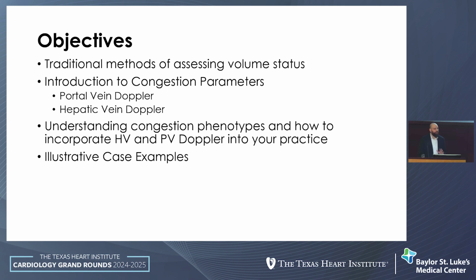I'm going to go through some very distinct illustrative case examples. These are real-world examples. And lastly, I'll talk about the current research that we're doing and the future directions and where this is headed.